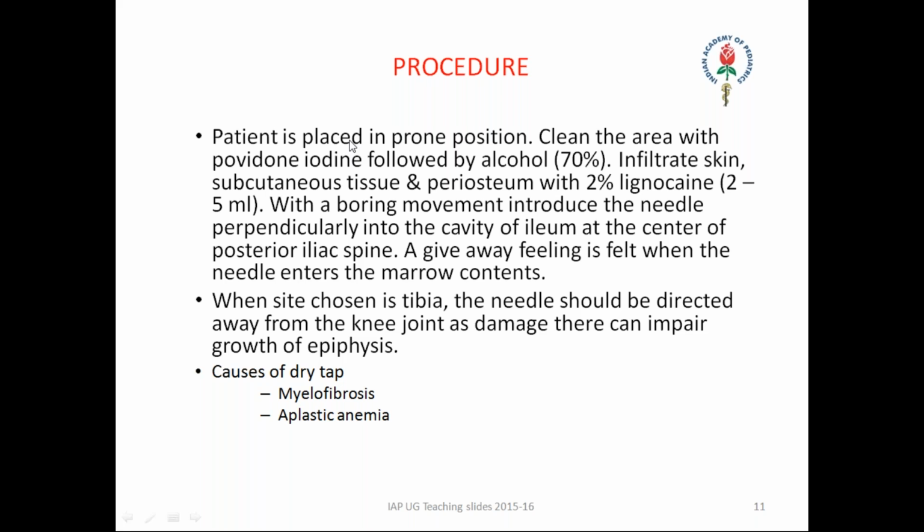When the site chosen is the tibia, the needle should be directed away from the knee joint, as damage there can impair the growth of the epiphysis. What are the causes of a dry tap? Myelofibrosis and aplastic anemia, you can expect a dry tap.